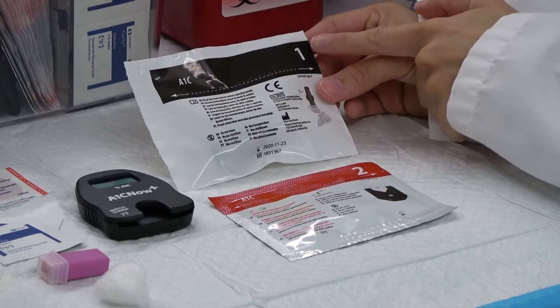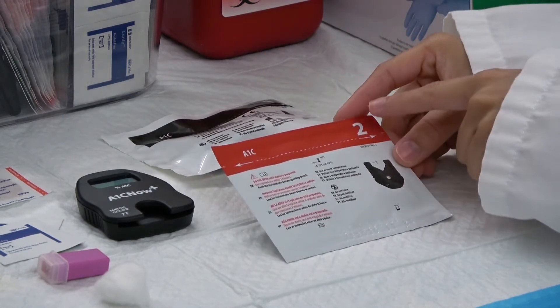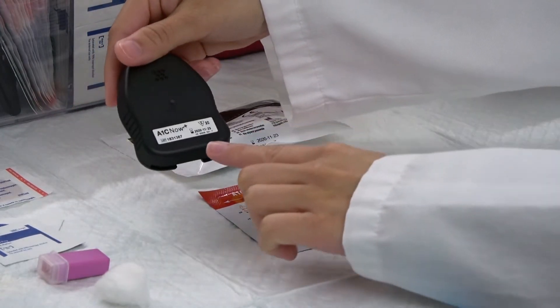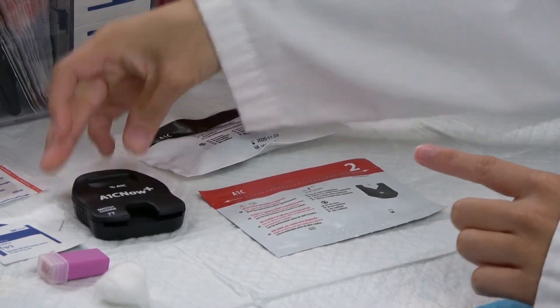Check package 1 for lot and expiration. Check package 2 for lot and expiration. Check the A1C meter for lot and expiration. All three should have matching lot and expiration.